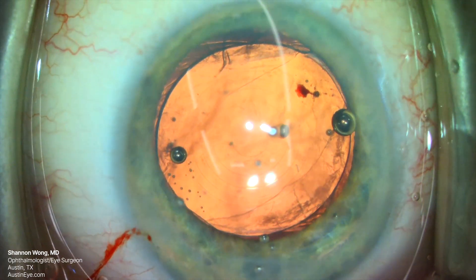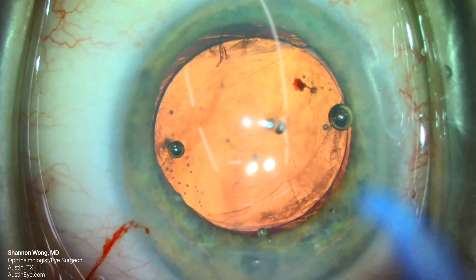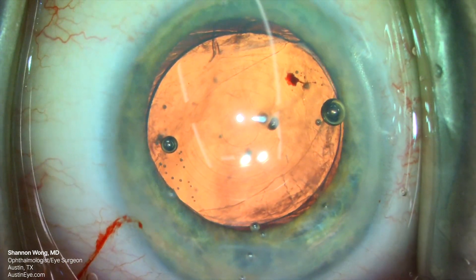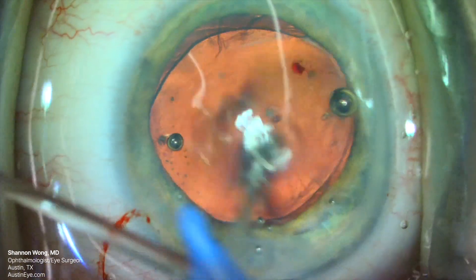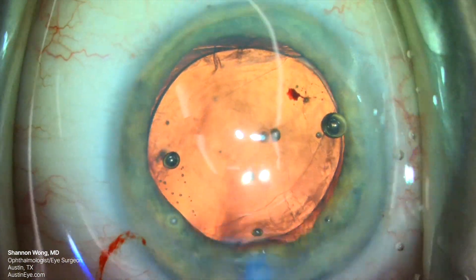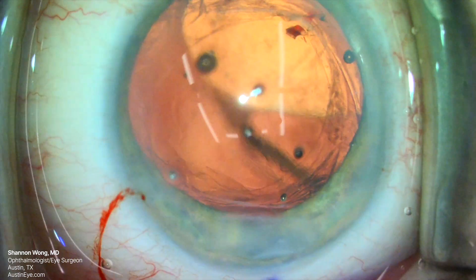The eye is filled with Healon GV viscoelastic to stabilize the anterior chamber. Our PanOptix lens is in excellent position. We will now lower the bottle height of our infusion to the lowest possible position, then introduce our irrigation and aspiration handpiece in a low-flow irrigation setting.